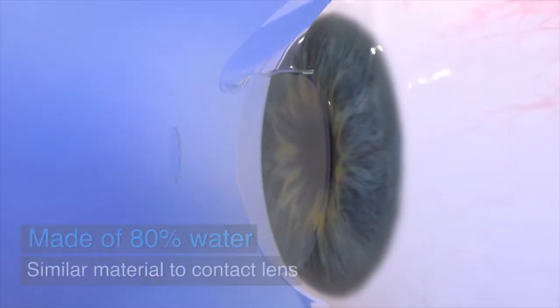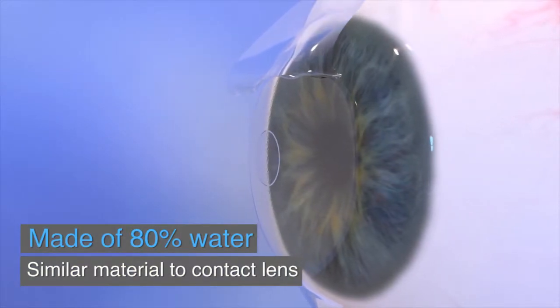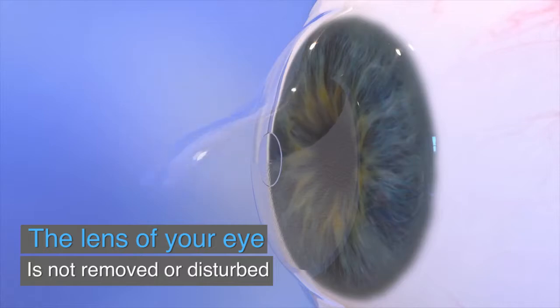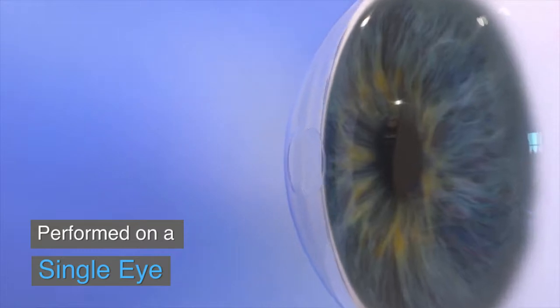Raindrop is a small transparent disc made of approximately 80% water and is similar material to a soft contact lens. Unlike other procedures to fix the need for reading glasses, Raindrop does not remove or disturb the lens of your eye.